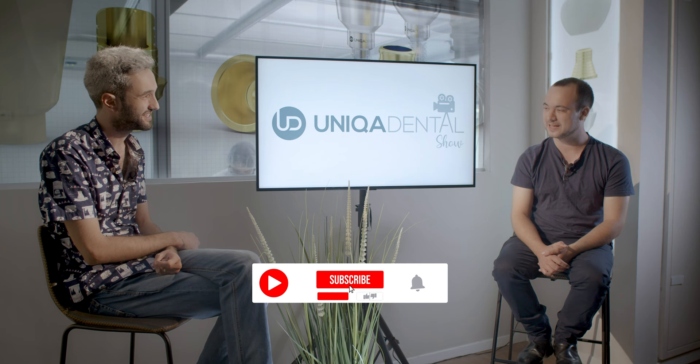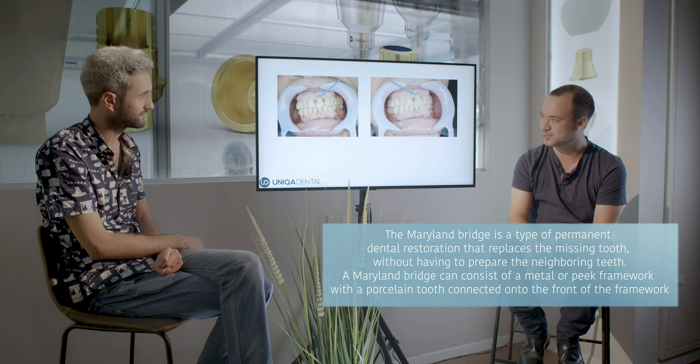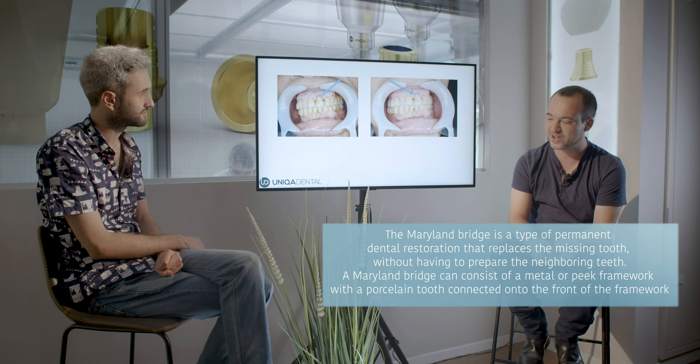Today we're going to discuss a case where we used old implants for temporary restoration and made a restoration that is something like a screw-retained Maryland bridge. It's something that's not widely used — probably I didn't see it anywhere, to be honest. But it's a great solution when you already have the implants and you extract a tooth and need to replace it somehow.